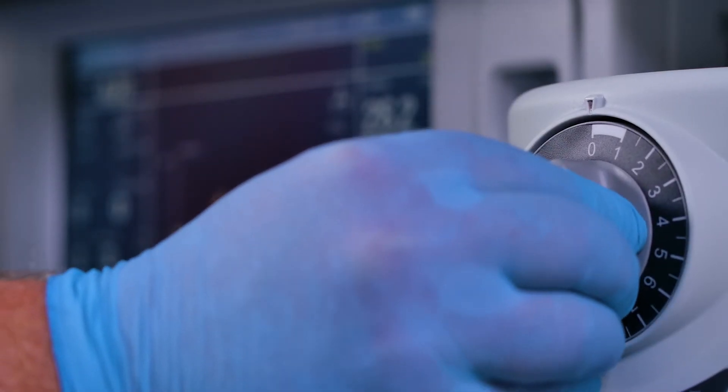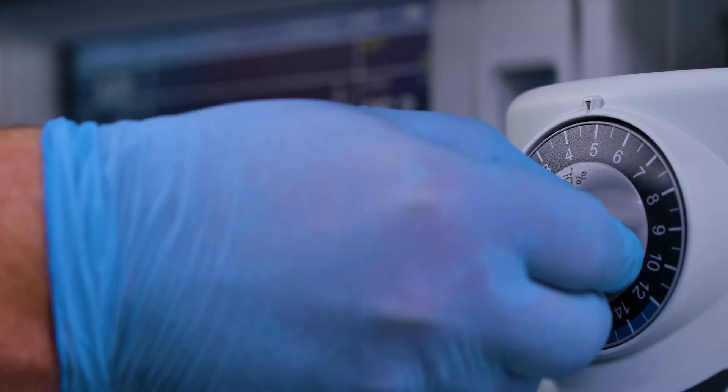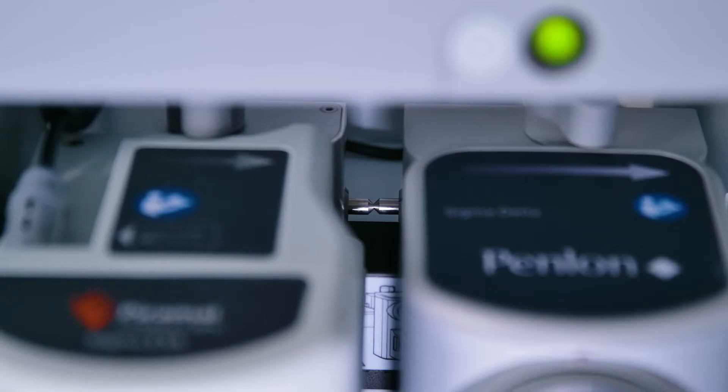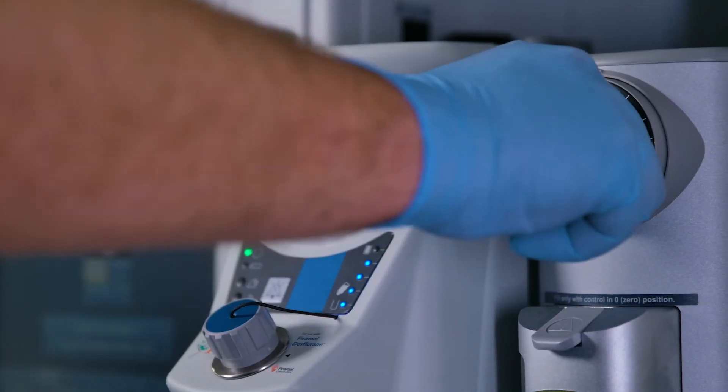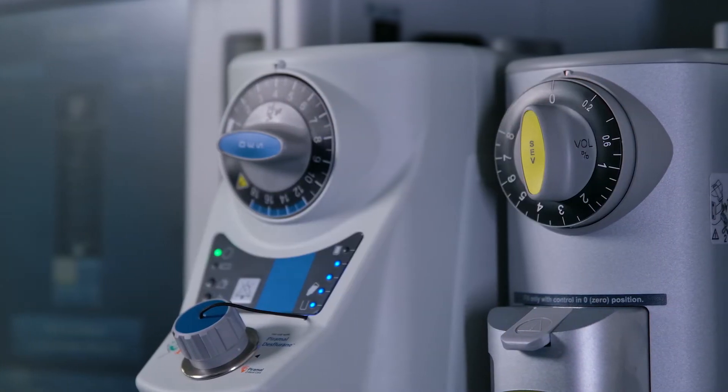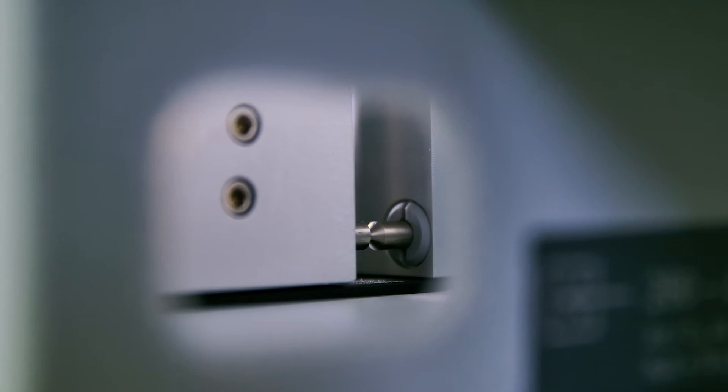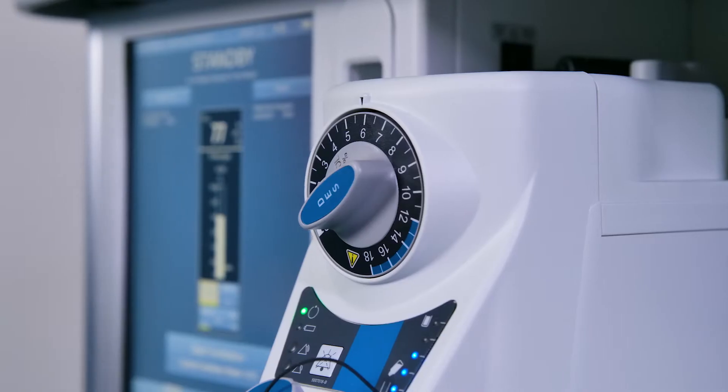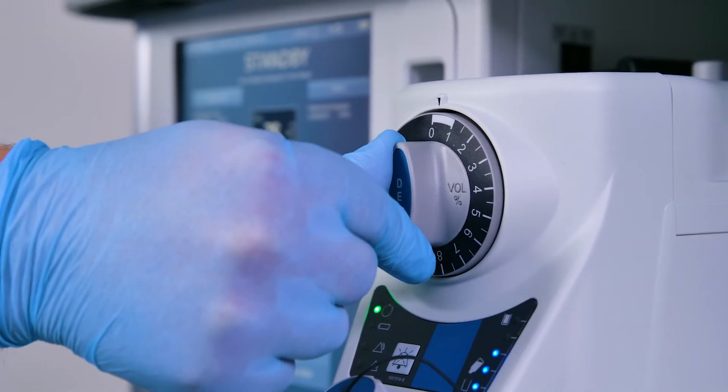Push in the concentration control dial and rotate anti-clockwise. Check that the interlock bolt moves outwards so that only one vaporizer at a time can be turned on. Check that the interlock deactivates when the control dial is returned to the locked out zero position.